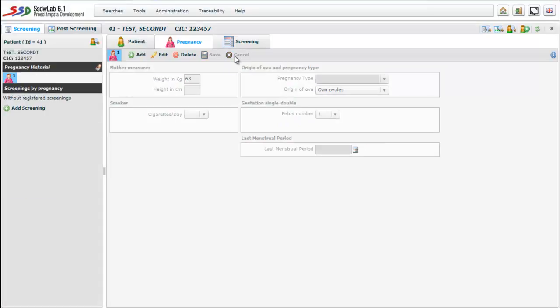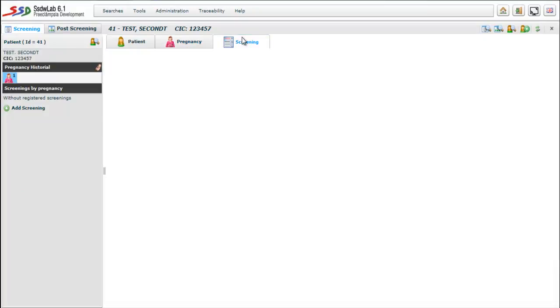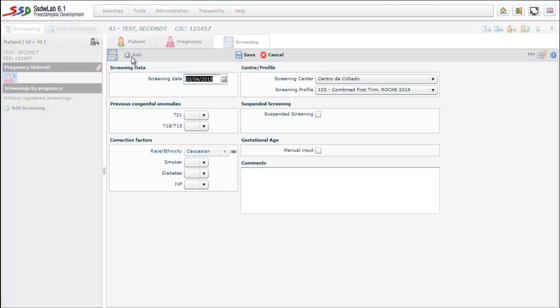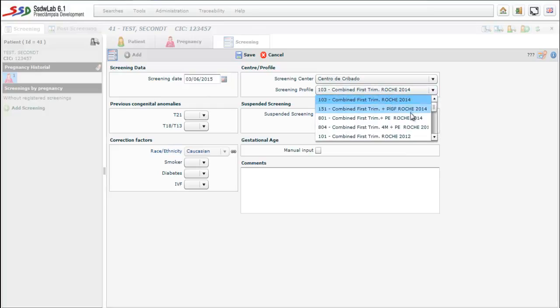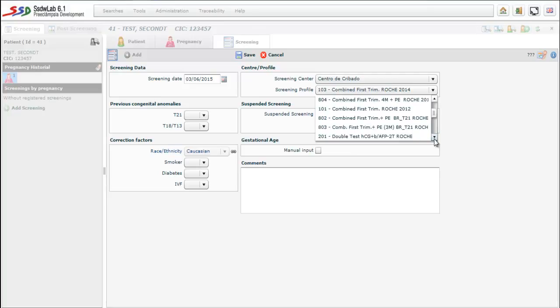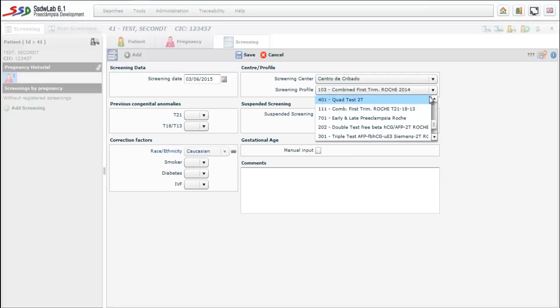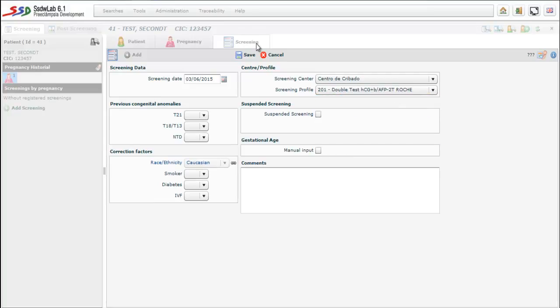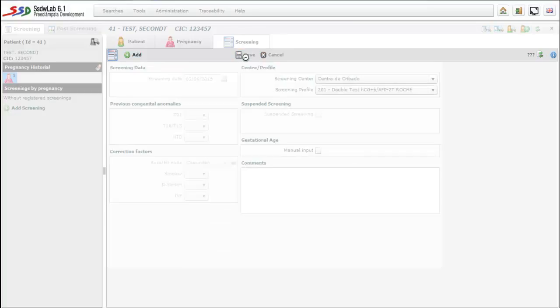The following folder is the screening folder. We must enter the date of screening, that is the date of blood sample extraction. We also introduce the screening profile. We chose a double test, that is a second trimester screening test. We can observe that there is a section regarding previous anomalies and another that refers to the correction factors. We can note that white race is marked as we have previously defined.